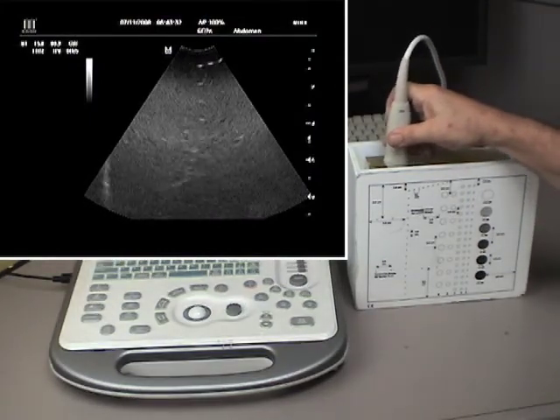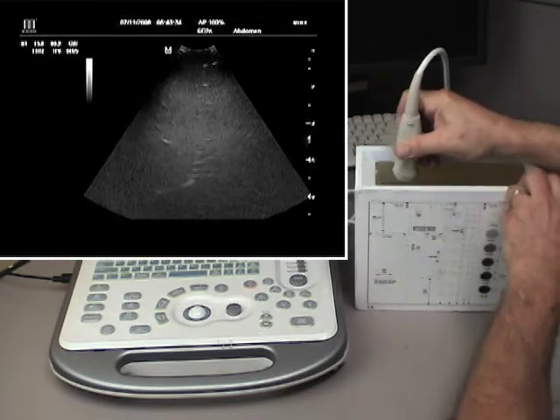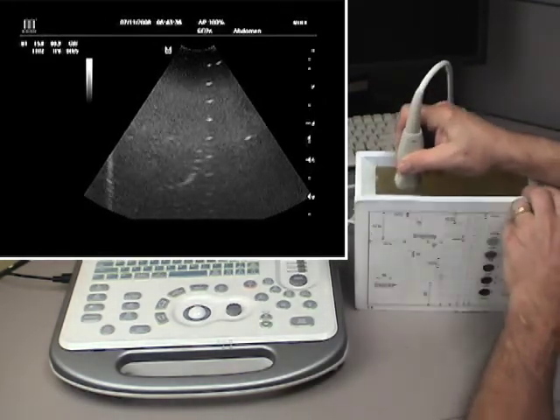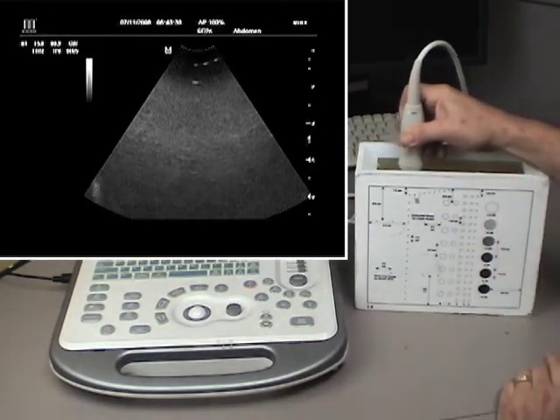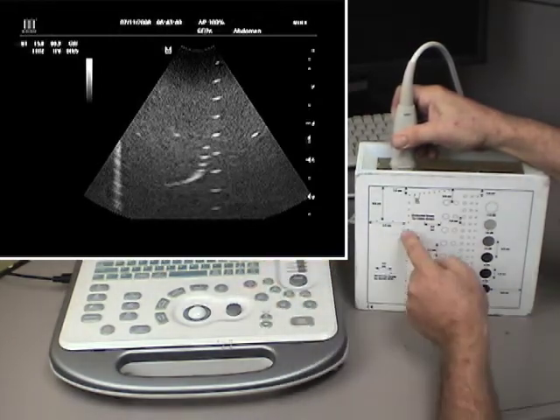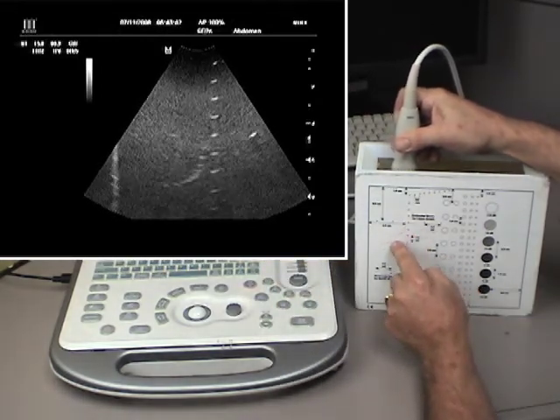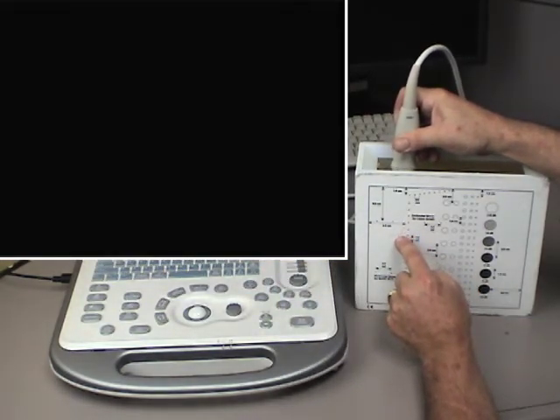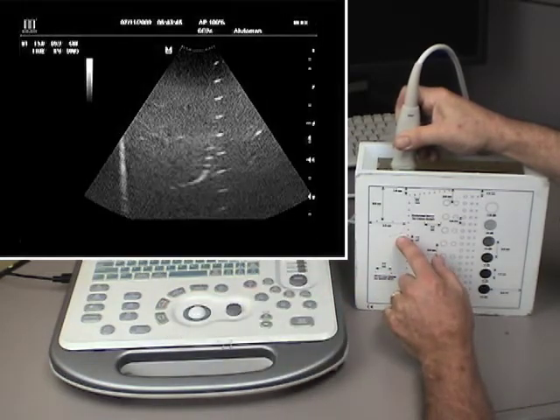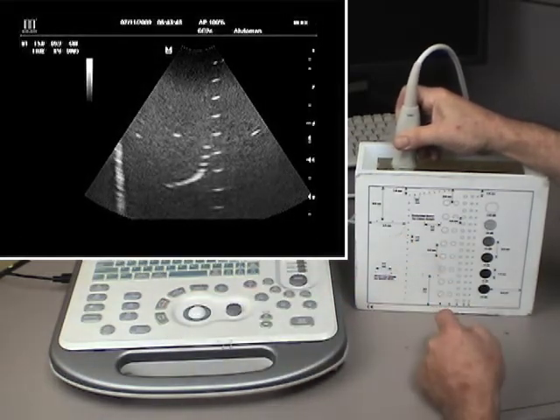Put the transducer on top of the phantom, have it covered with gel to make good contact, and you'll see a representation on the monitor very similar to what you're looking at here. You'll see that these are actually very small, one-millimeter pins, or wires going across there.